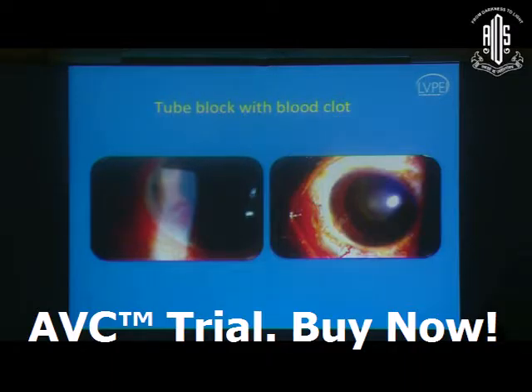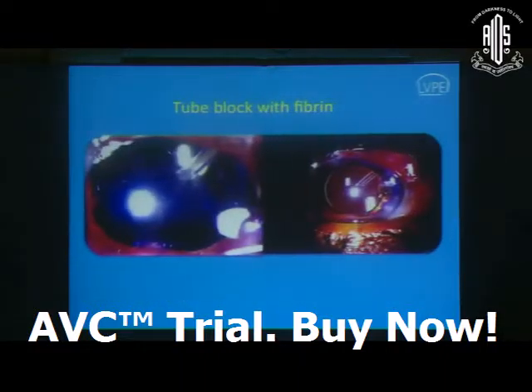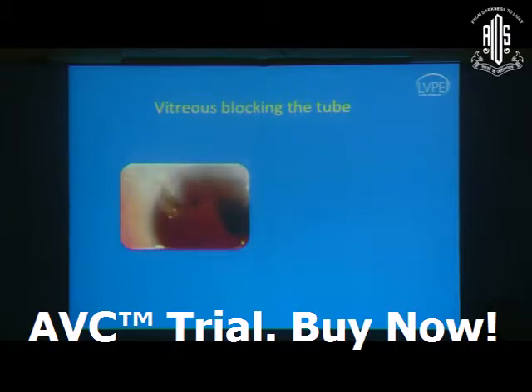We don't have to go and wash, don't have to do any of those things. In case the pressures are high because the tube is getting blocked, you can treat them with aqueous suppressants for a short period. Meanwhile, the clot will disappear. So this is the same patient where there was a clot and in about a week's time the whole thing disappeared. Sometimes we can see the tube being blocked with fibrin. This has to be differentiated from vitreous because vitreous is something that we cannot leave and that's not going to disappear. But in the early postoperative period, if you have fibrin like this, just increase the anti-inflammatory and that will disappear too. Sometimes you can have vitreous blocking the tube.